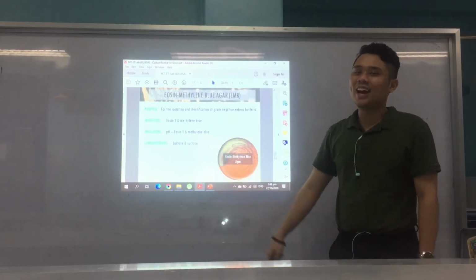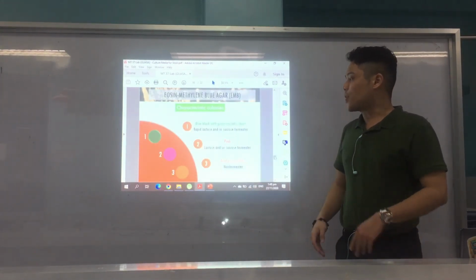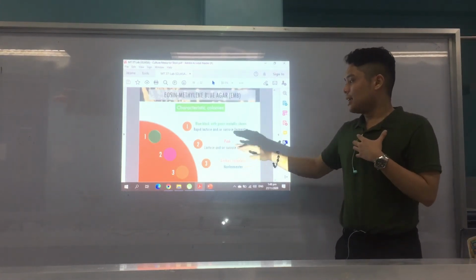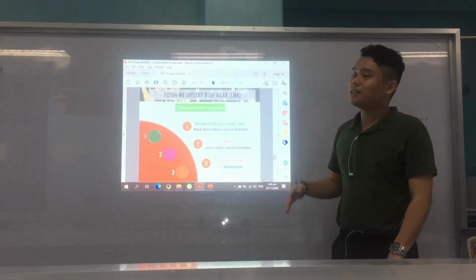It's already in the name. Okay? Alright. And carbohydrates, lactose and sucrose. Alright. Characteristic colonies: blue-black with green metallic sheen, rapid lactose and/or sucrose fermenter. Pink, lactose and/or sucrose fermenter. So, it's not rapid, like after a few hours of incubation. And if amber or colorless, non-fermenter.